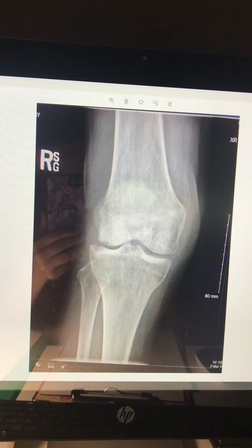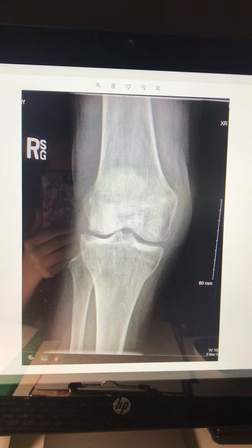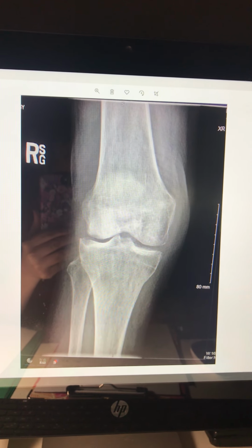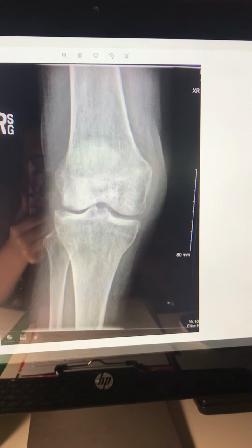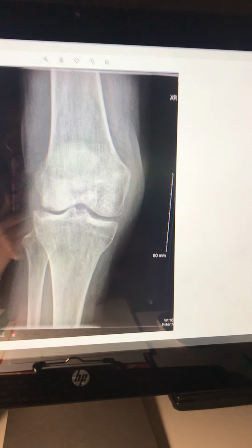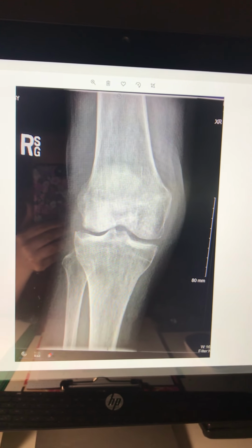The patient laid flat on the X-ray table. The CR was angled perpendicular to the apex of the patella. There is slight rotation indicated by the lateral aspect of the patella. It should be in the middle. The patient was in a lot of pain. For her back, an extra blanket was placed to support her.